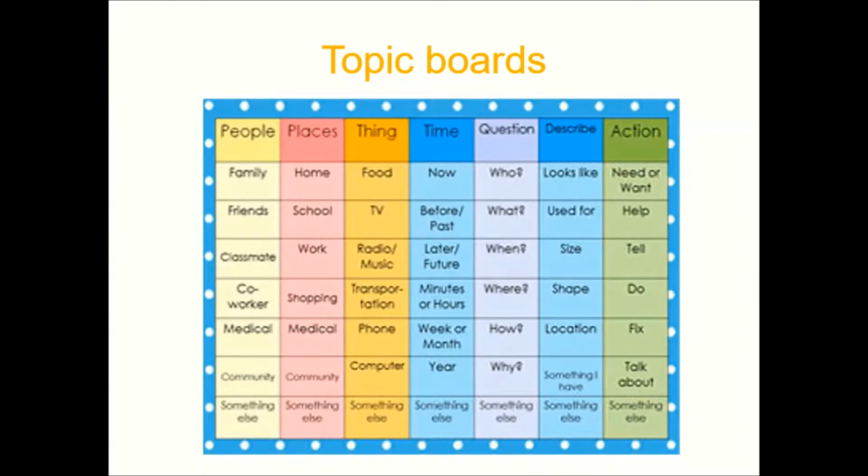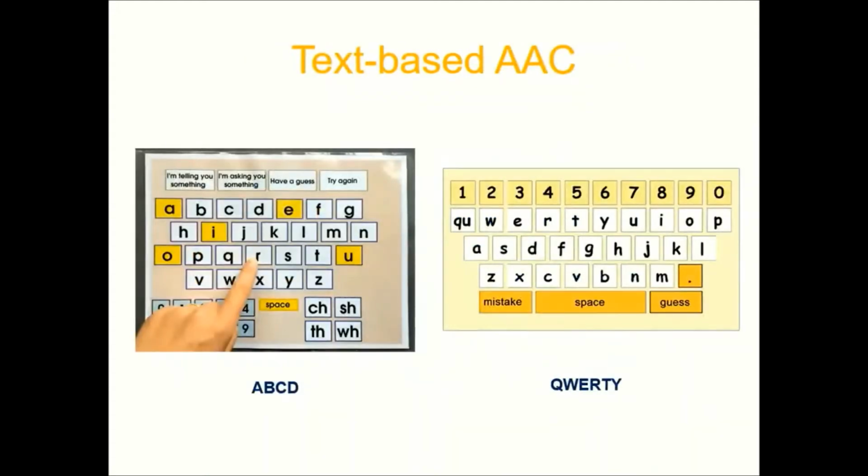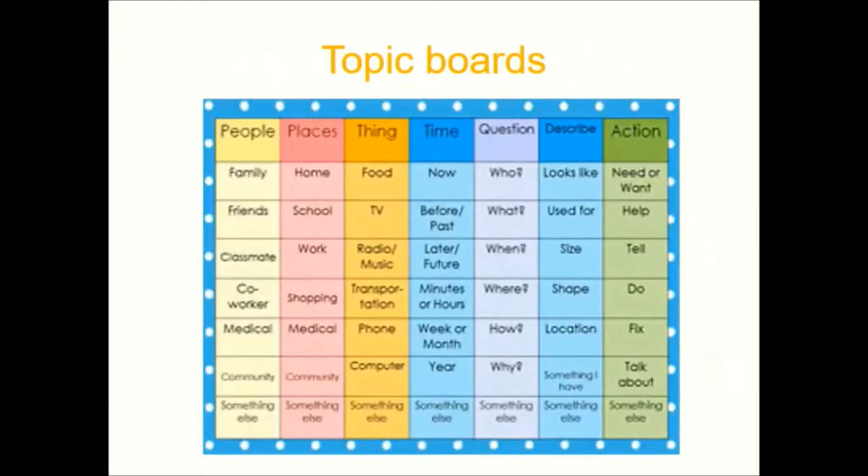The other way that this can be used is as a conversation starter. So you can ask your client, what do you want to talk about today? And then they can indicate. So this can be quite nice. And of course, you can use this in conjunction with your letter chart. So you might start off with this. This might be on the front page of their communication booklet. And you say to them, what do you want to talk about today? Oh, you want to ask me a question. Okay. And then they can flip over to their letter chart and then they can ask you the question. They can spell out the words that they wanted. So you can use these in conjunction.